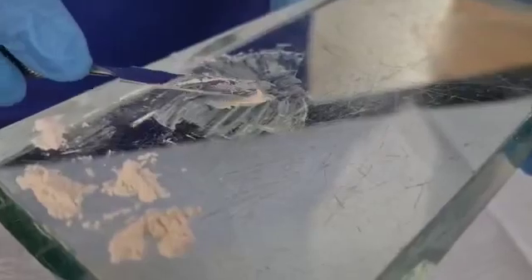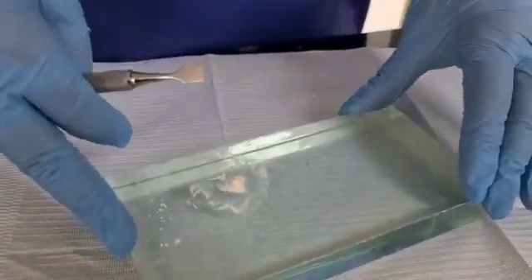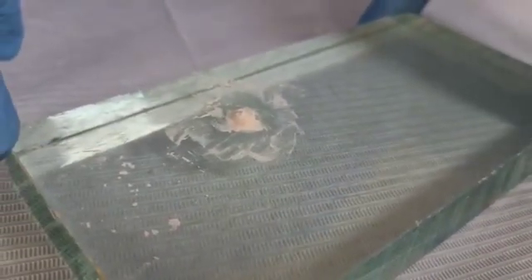This is calcium hydroxide so it does not escape. If you are using clean gloves and have not contaminated the mixing materials, and if you have excess powder kept at the side of the slab, you can put them back for the next patient. But because you need to clean the slab, I would always prefer to keep them back in the bottle.